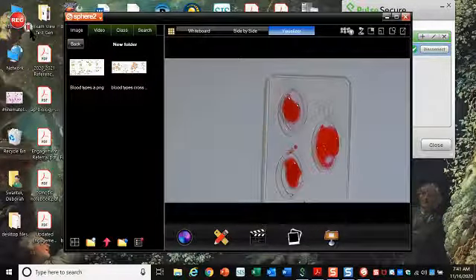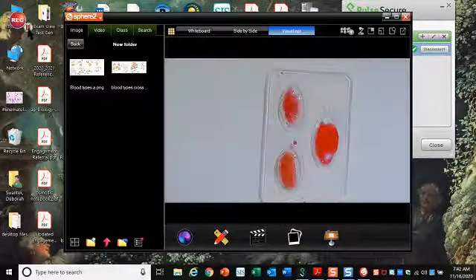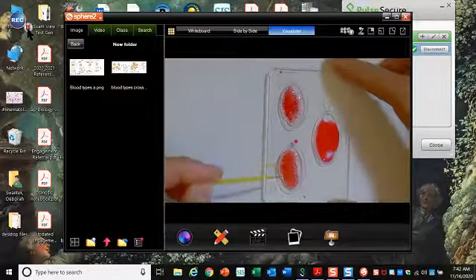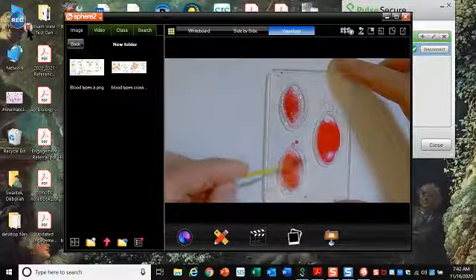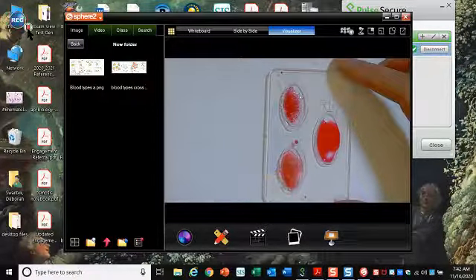I'm going to pause the video and come back in about a minute. Okay, so I've let this sit for a minute and I've mixed it so that we can see the agglutination.